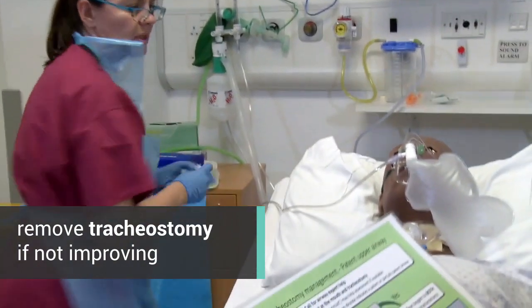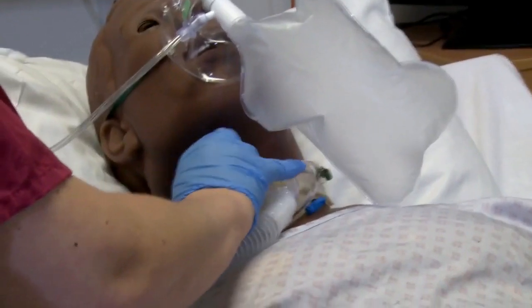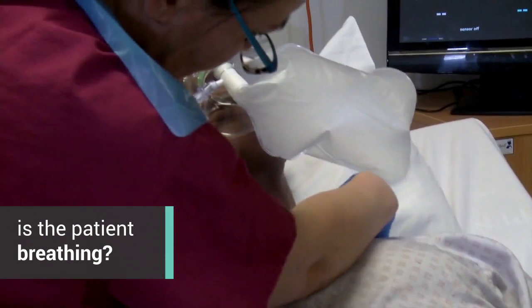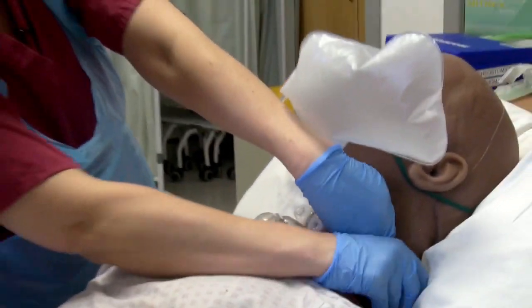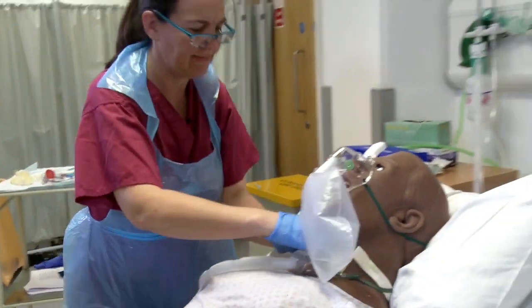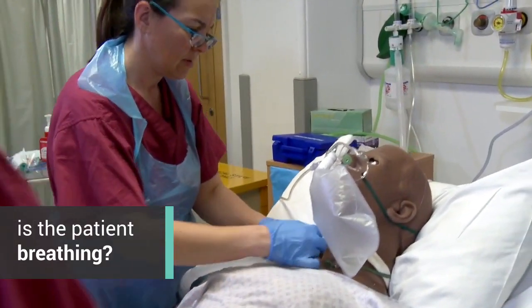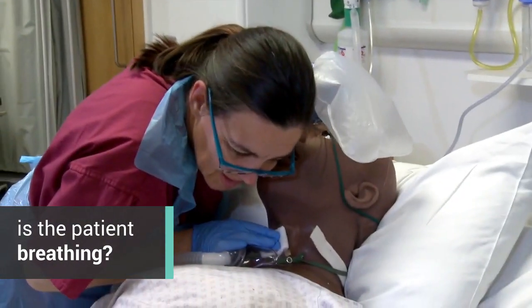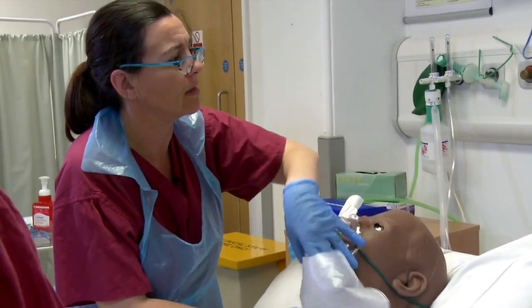I'll just get some swabs. Do we think we need some more help here? Once that tube's come out, are there any signs of breathing? Just untie the ties first, Robert. Tube out — it's totally blocked. So any signs of breathing now? He is shifting some air, he is breathing, but I reckon it's about three breaths a minute.